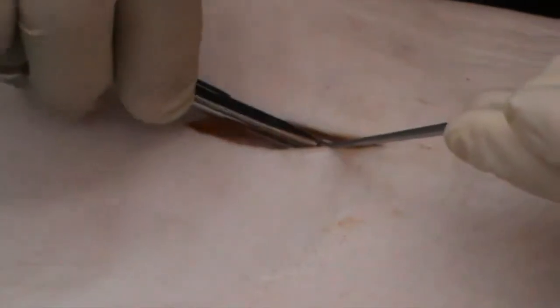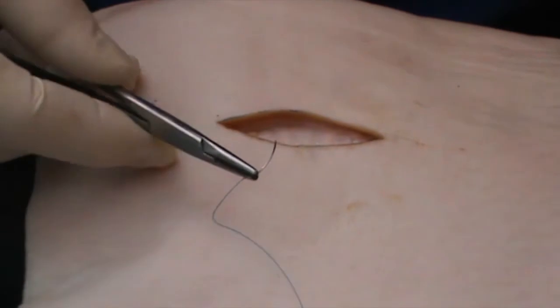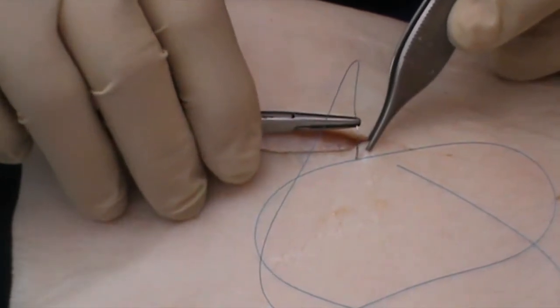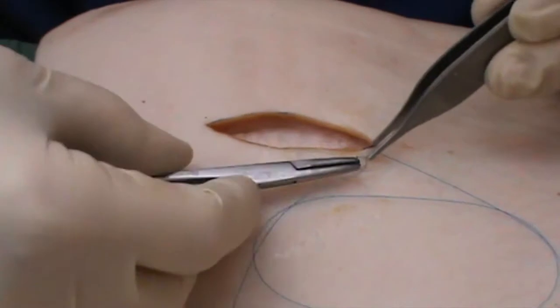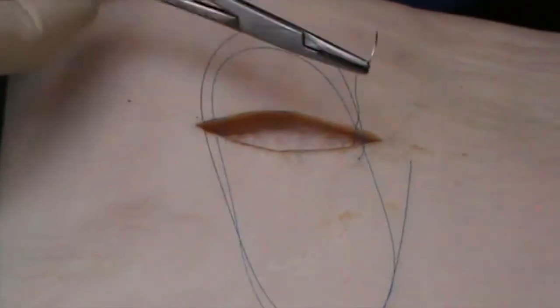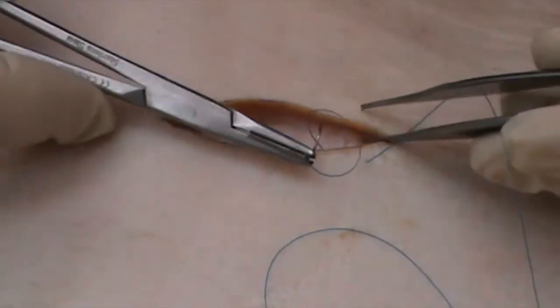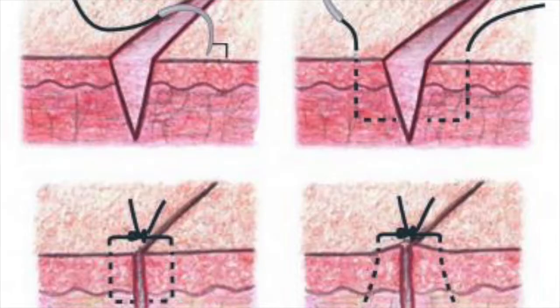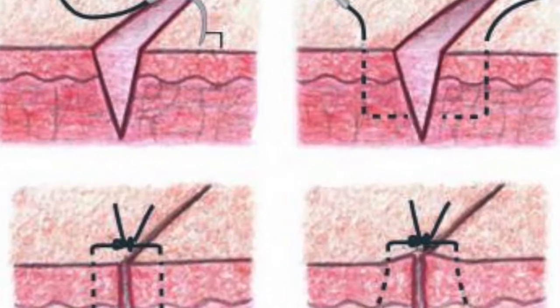You'll note that this is done as blunt dissection. As soon as you feel that you've undermined the area well enough, if this is going to be closed entirely by superficial sutures, we would be using something like this — this is proline or ethylon. The idea here is to insert the needle at 90 degrees down to the depth through the dermis that you require, and then for the other side to be exited again at 90 degrees. So in at 90 degrees, out at 90 degrees.